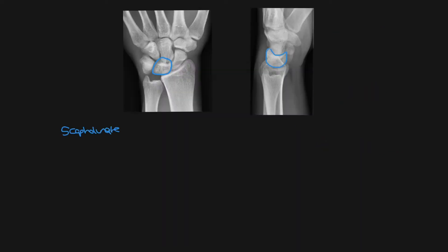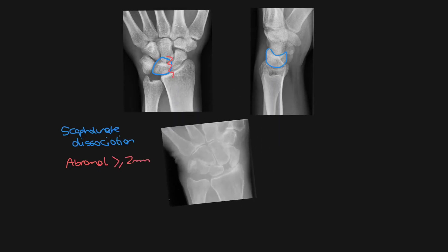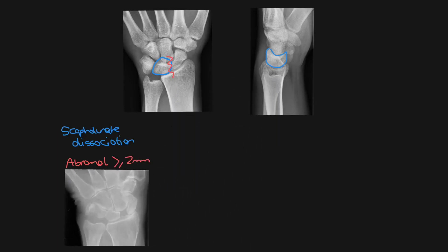Let's take a look at the injuries related to the lunate bone, which fall in a spectrum. At the least severe end of the spectrum is a scapholunate ligament dissociation. On a PA view you shouldn't see a distance of more than two millimeters between the scaphoid and the lunate, as is seen here in this example, which confirms a scapholunate ligament dissociation.